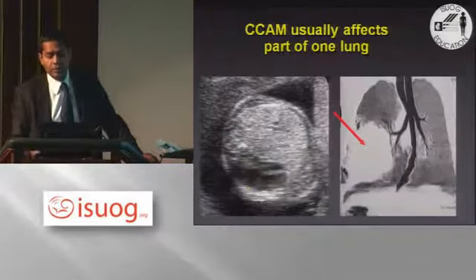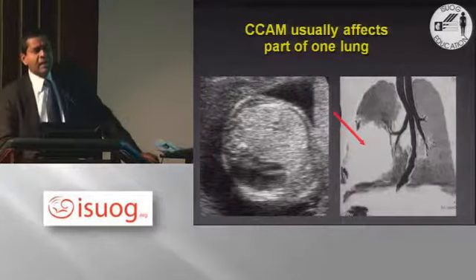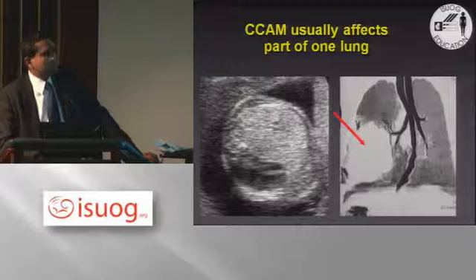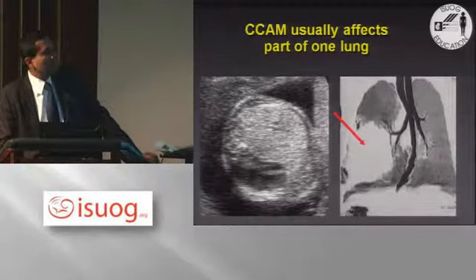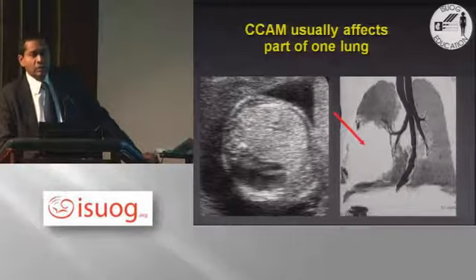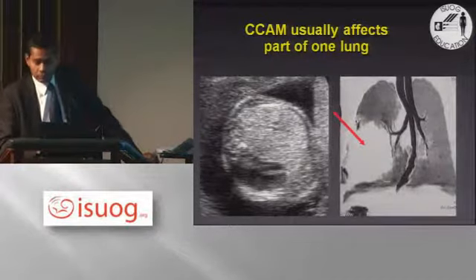So far, simple. It's very important for us to realize that CAMs are usually unilateral. Greater than 95% of CAMs are unilateral. It is relatively rare to see bilateral echogenic lung lesions, and when you do so, that is when the diagnosis of CHAOS should be borne in mind.